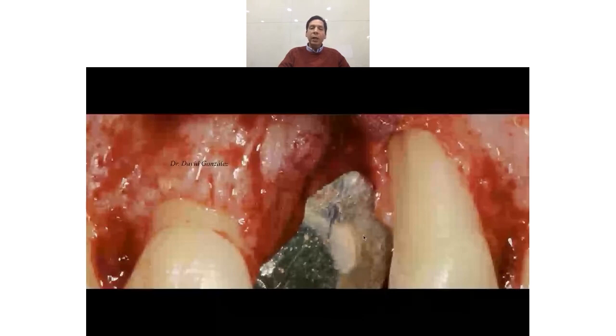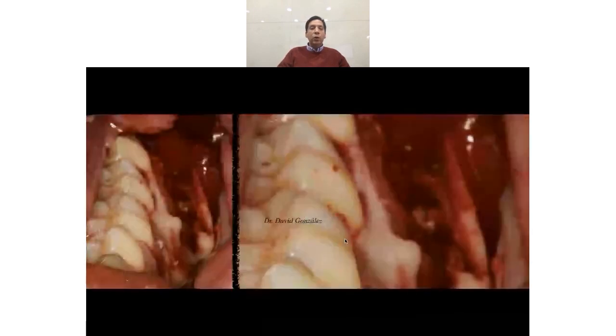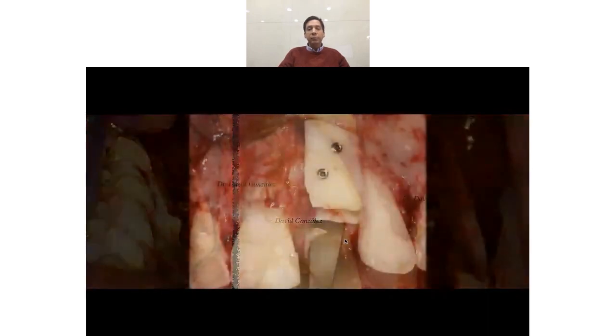But I am a periodontist. I will try to keep this tooth, the lateral incisor, and I don't mind this. I will be very careful, and I will try to regenerate this area, the mesial area of the root of the lateral incisor. So I go to the mandible, to the left side of the mandible, and I extract a block from the external oblique line.